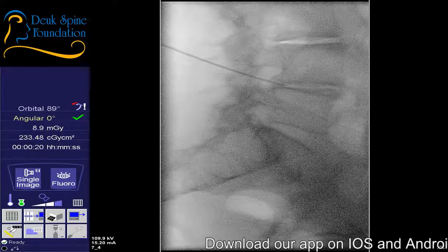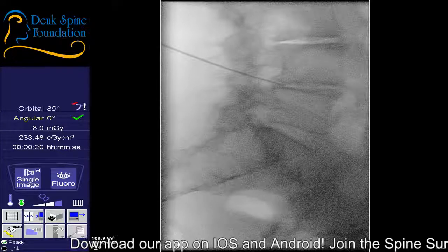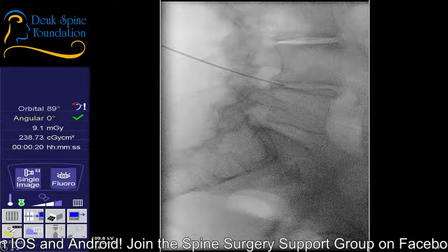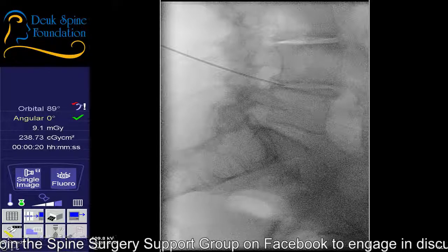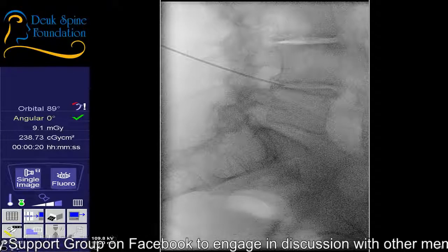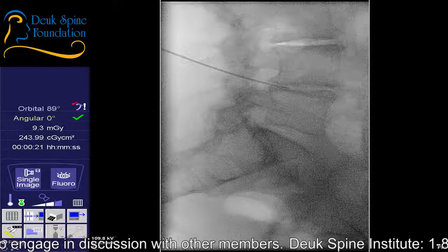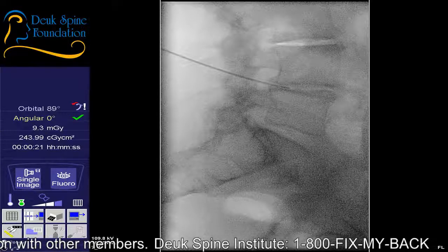We're awfully close though. And I can feel she's pretty relaxed, so you're not having any pain? No? All right, I'm going to give us just another minute here to finesse in. But I feel that we're in an area that it's safe to proceed. We're just not going to get a very good discogram. Well, all right, not too bad. I just don't know why it's not going. I like it to just do what I want it to do, of course, as we all do, but shot.